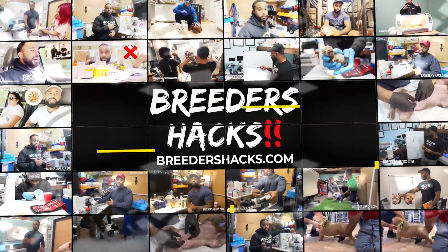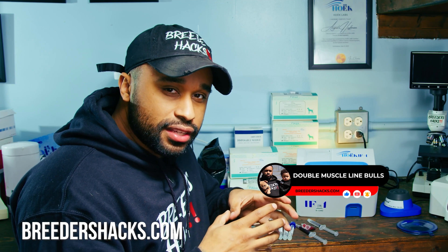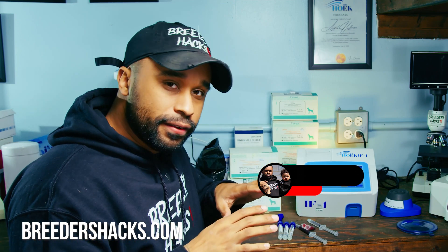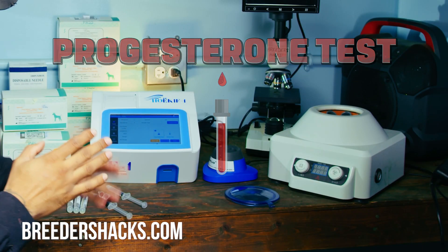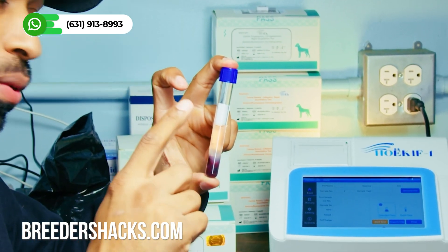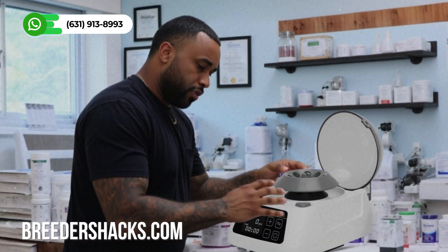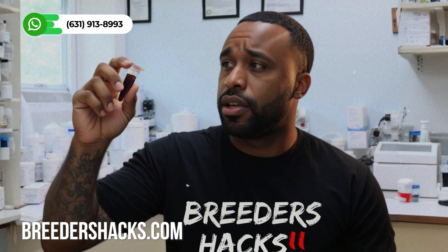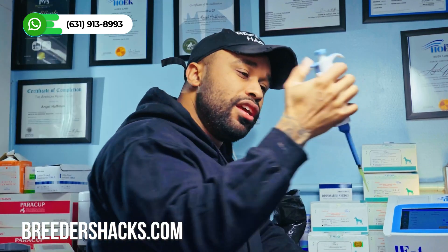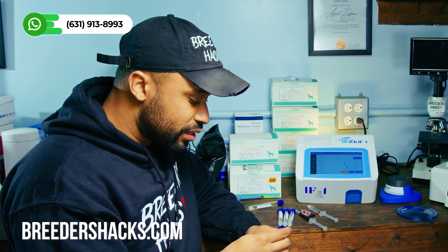What's going on, Bully Fam, dog breeding family! I wanted to show you guys something I'm super excited about. We were about to do a progesterone test, and anyone who does a progesterone test knows that you want to get perfect separation — perfect serum. The frustration is I've had it happen so many times where I spin the blood and it gets thick and clotted and I can't use my pipette to get the serum out to perform my test.